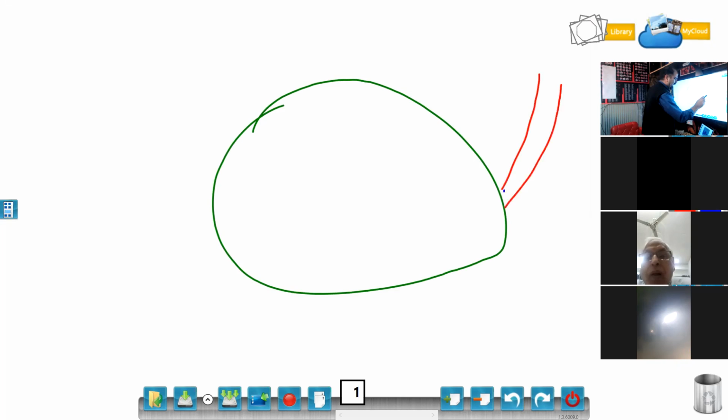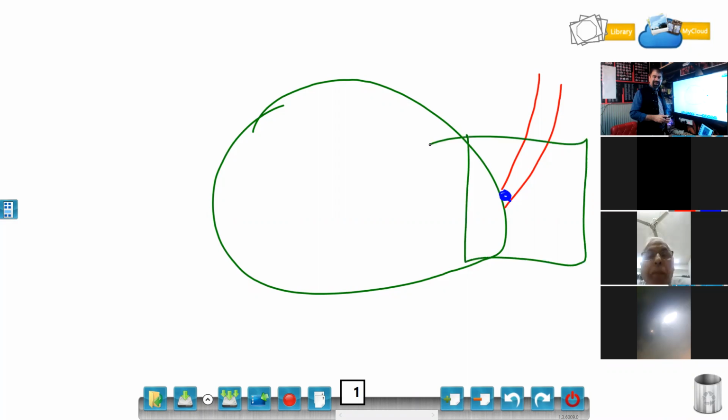If you are suspecting that there is a calculus, but you cannot make out this calculus very clearly, then put a color box onto this area of suspected calculus. And if it shows you, I'm using the word if, not always, if it shows you a twinkle artifact, it has to be 100% ureter calculus. So not all ureter calculi will show you the twinkle artifact, but more than 95% of ureter calculi give me this twinkle artifact, and this is a very beautiful sign to confirm that the above structure is the ureter calculus itself.